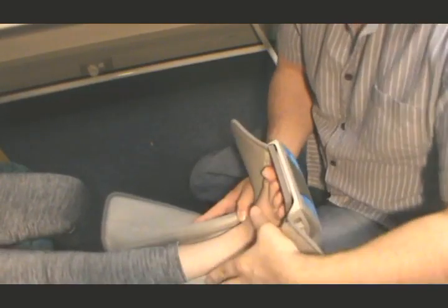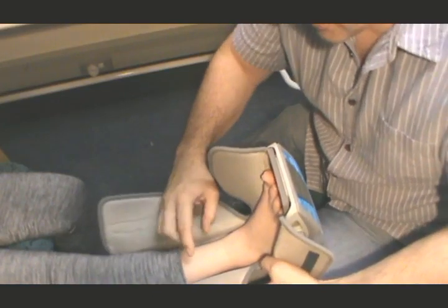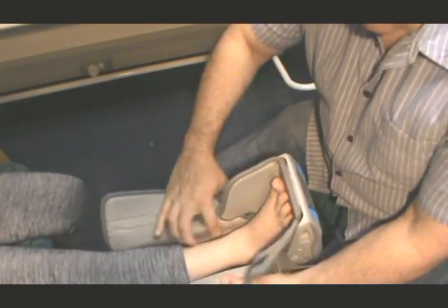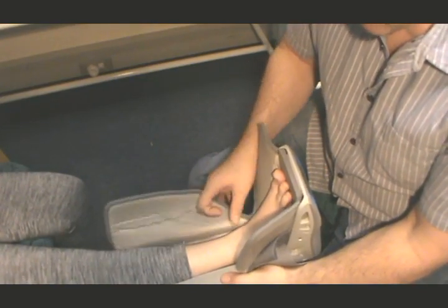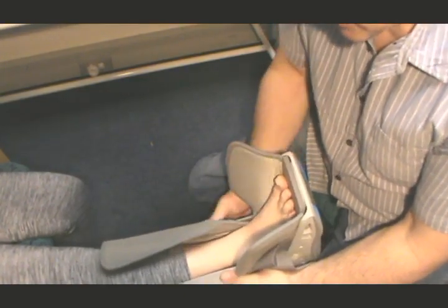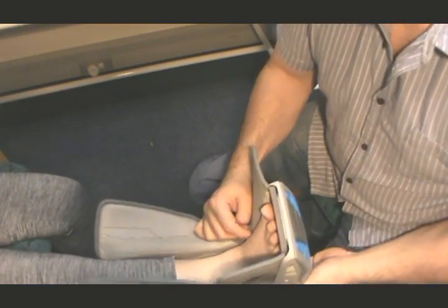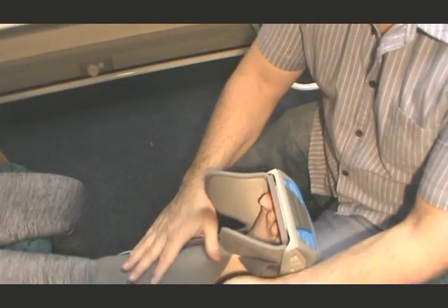So, the first thing you want to look at is if you've got surgery, and Amy doesn't have any surgery on her ankle, but after surgery normally this ankle section is pretty swollen. So you want to make sure that the ankle is not touching on the side of the boot, because otherwise it might cause a bit of a pressure sore there. So I can see that Amy's foot is in there perfectly. I also then just make sure your heel is all the way in the bottom and touching the boot at the bottom. So once I've got that, then you would then put the foam on.